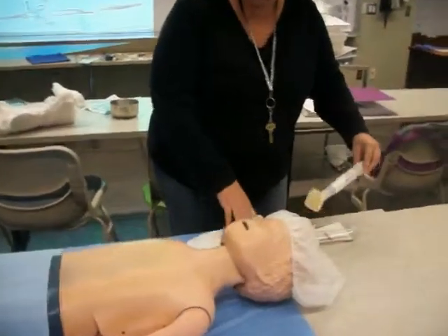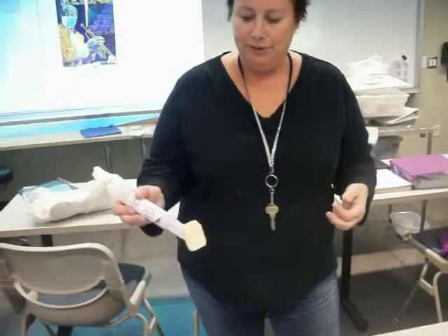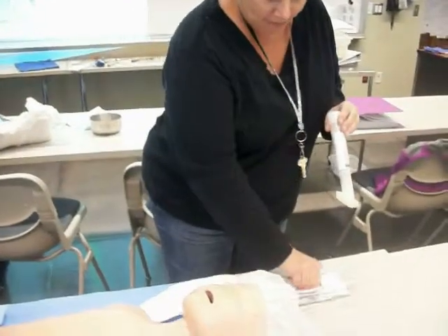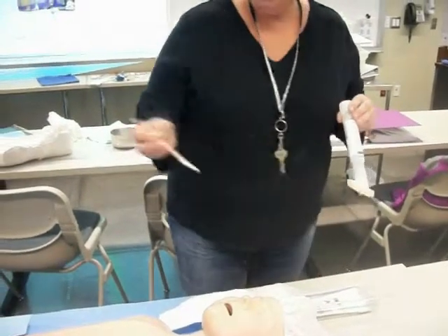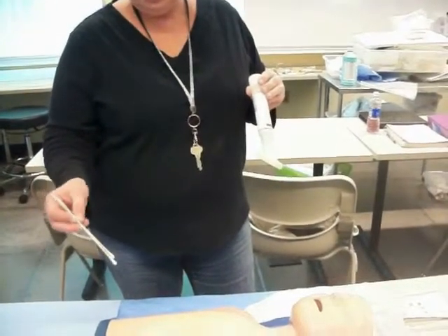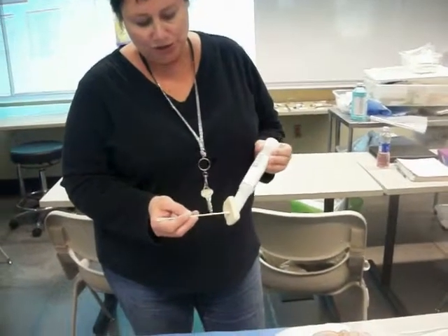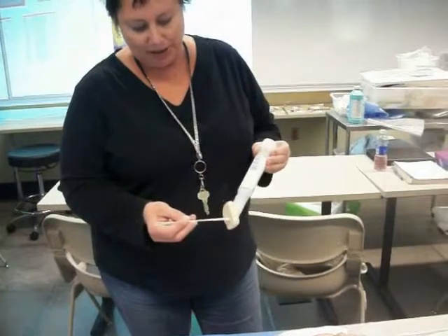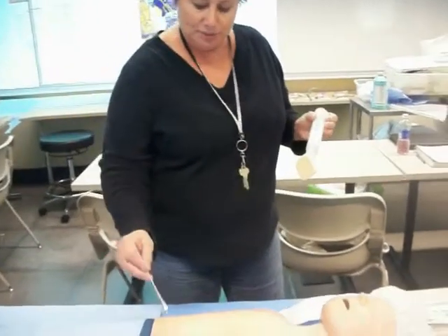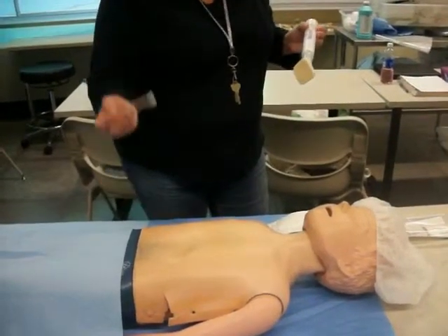I'm going to pick up my wand, and what you want to do is snap your wand — and you'll hear it snap. Wait for the betadine to come onto the pad, and then you're going to pick up your Q-tips. You can use both at the same time or one at a time, depending on the size of the umbilicus and the size of the patient. I would get my Q-tips full of the DuraPrep solution and clean the umbilicus.